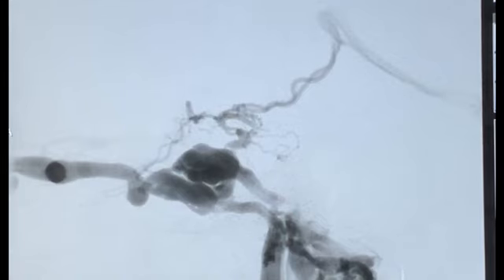And meanwhile, I'll take a roadmap through the vertebral artery injection and the fistula site, which will be demonstrated much better, and then I can place my stent precisely over the fistula. So to do that, first I'm doing a balloon occlusion test and a fistulogram with a balloon occlusion to be very precise about the site of the fistula.